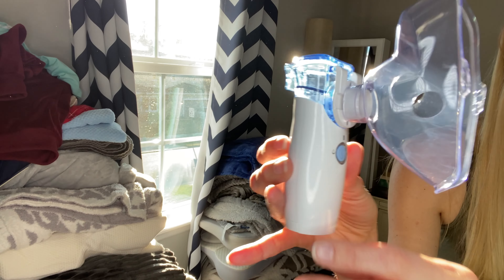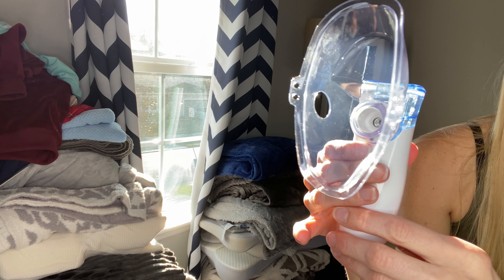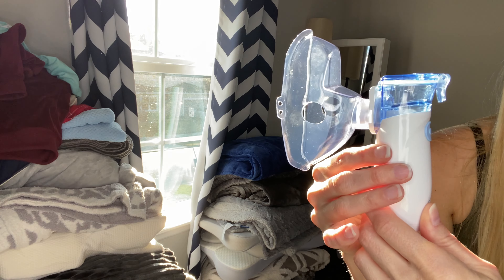And then here is the power button to turn it on and off. You would stick this over your face and just inhale. So it's pretty simple. This design is very easy to use — you don't even have to read the manual beforehand. It's pretty simple to put it together and to create the vapor that you need.